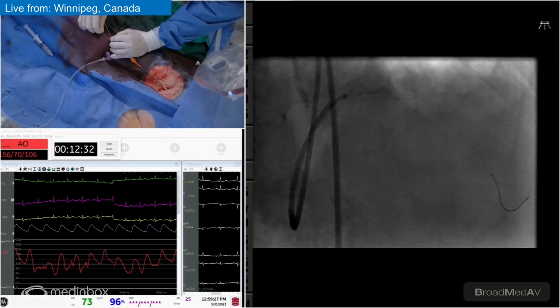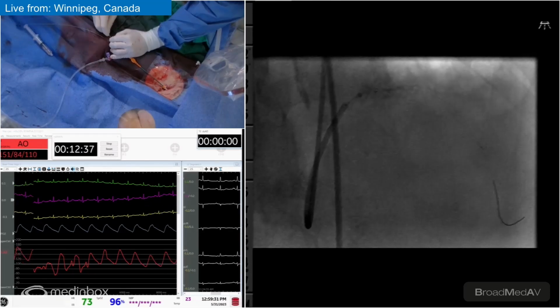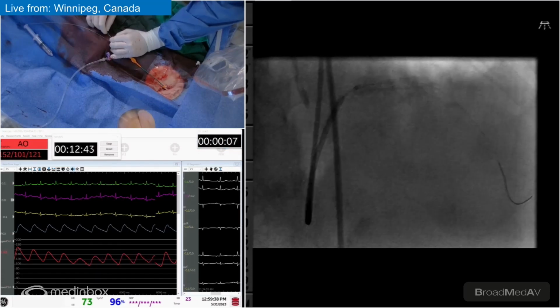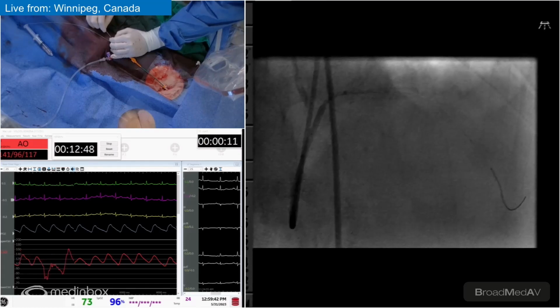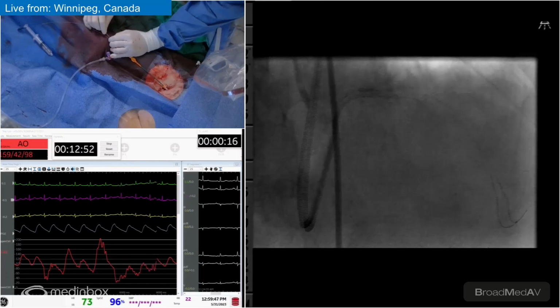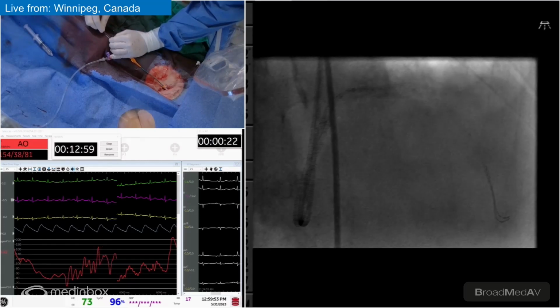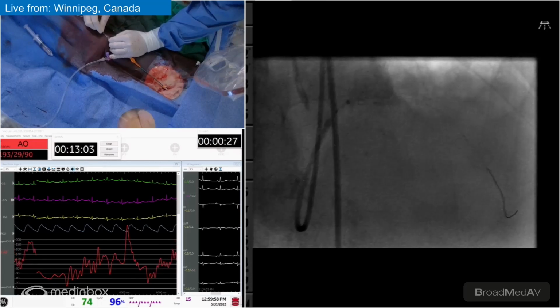Wonderful. So let's go up to 6. Let me know where you're at. Yeah, 6. Now we just push the guideliner in. Let's see if I can get the guideliner deeper in. Wow, it doesn't want to go in at all. Might be a function of your angulation of the guide now. You can trap the guideliner in. You do that, risk of injuring the ostium.